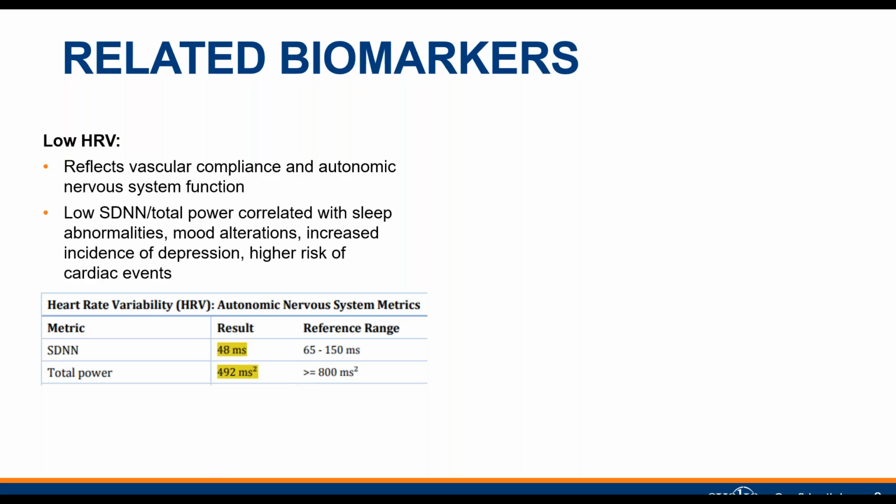The reason why is the vascular system is very tightly tied to blue brain. Sometimes targeting the vascular system itself will help resolve blue brain, and that's what Dr. Finney is going to be sharing with us later today with his case studies. So it's pretty common to see low HRV show up in a patient that has blue brain.